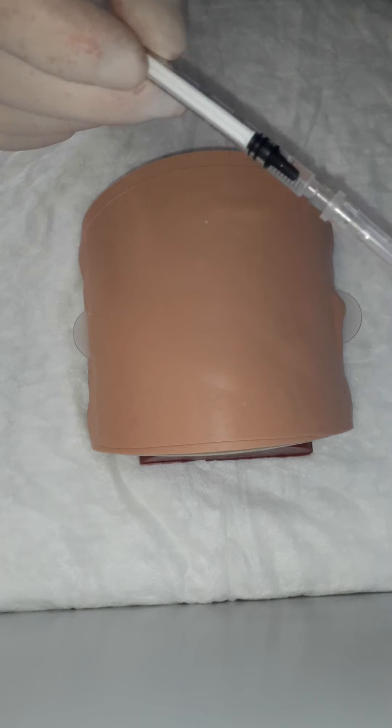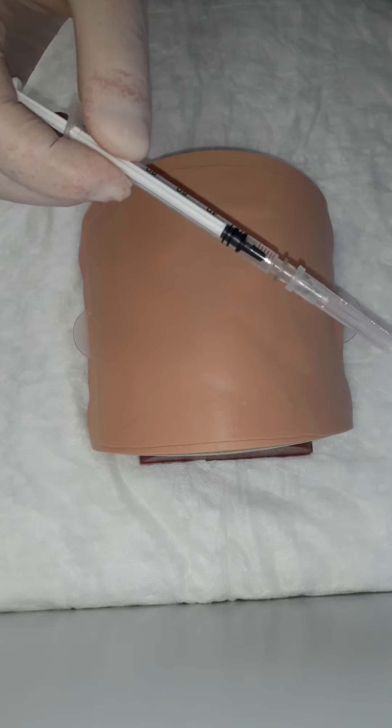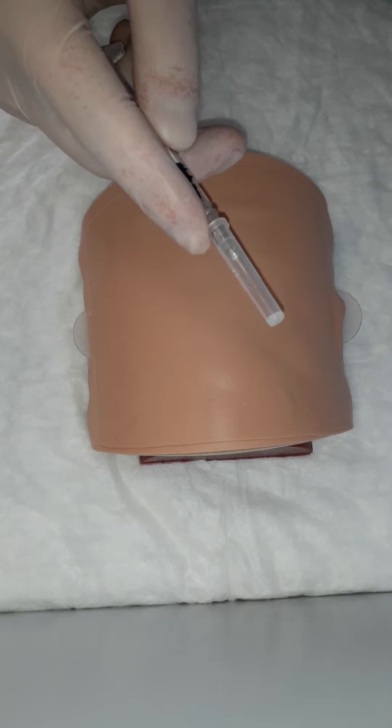On a 20 milliliter syringe, it's just impossible. So take an appropriate small one milliliter syringe for intracutaneous injections. Regarding needle size, the needle should also be small — 27 gauge.